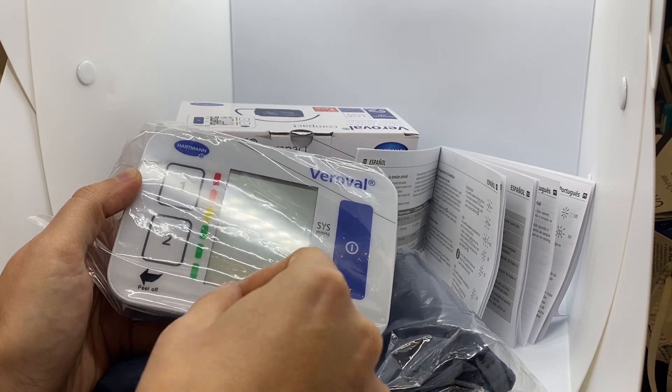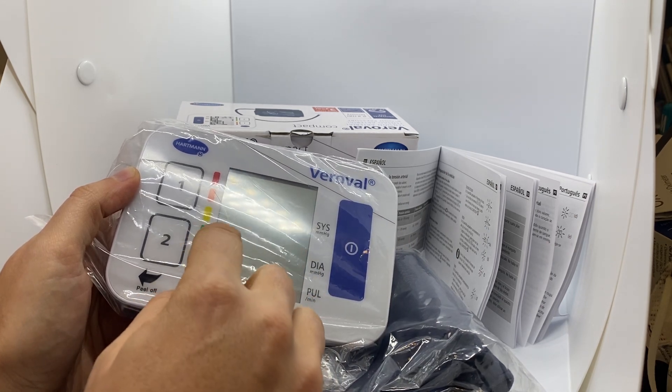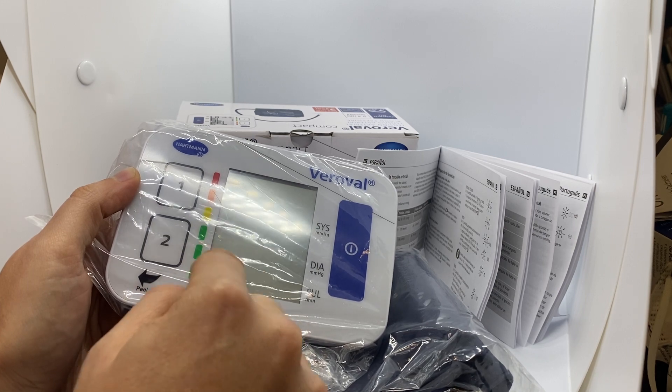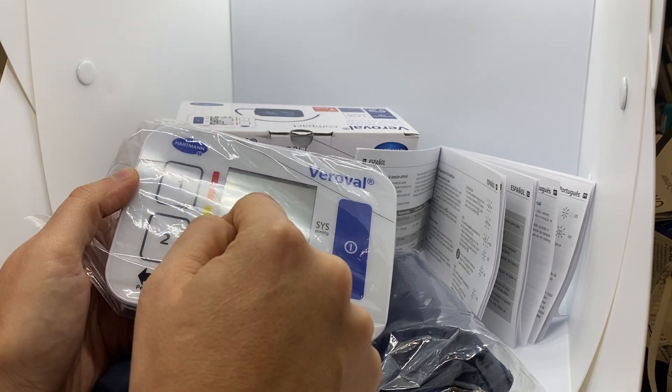It has an indicator that shows you if your arterial pressure is at good values or if it's too high and you have to go to the doctor.